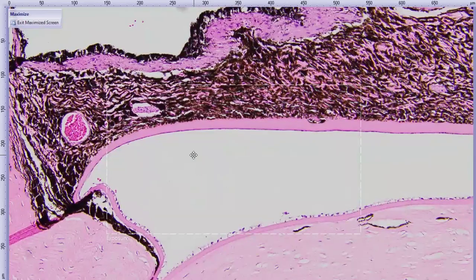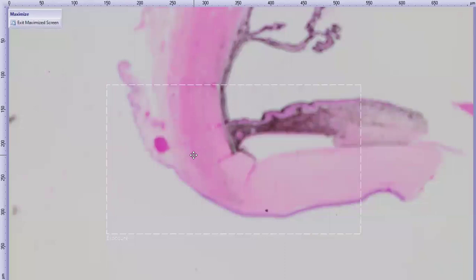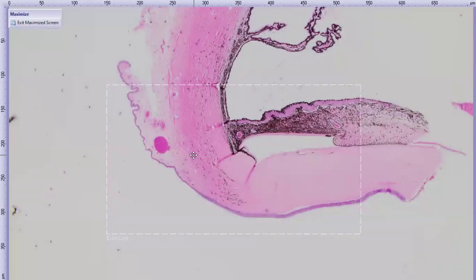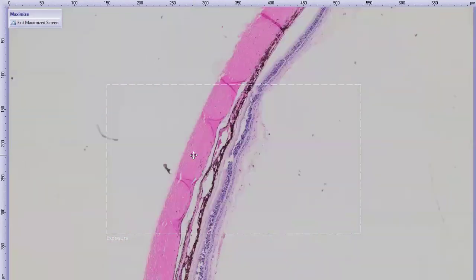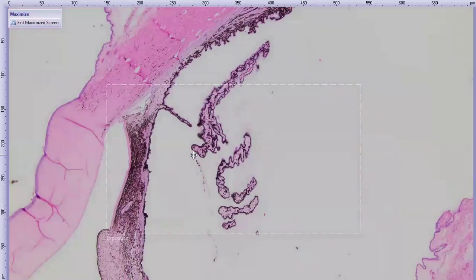And here is the best example of where it really continues right around. It is continuous. There is no ciliary cleft or opening of the ciliary cleft. So I was actually really surprised that this eye was not glaucomatous, especially given the tiny pupil and the posterior synechia. Anyway, so as we zoom around to look at these extra sections, it's very repeatable. So this was the most unique finding of this entire case, in addition to perhaps the advanced cataract.